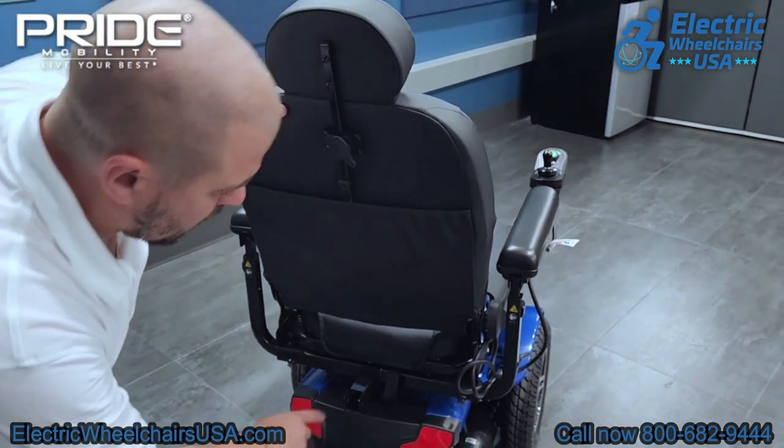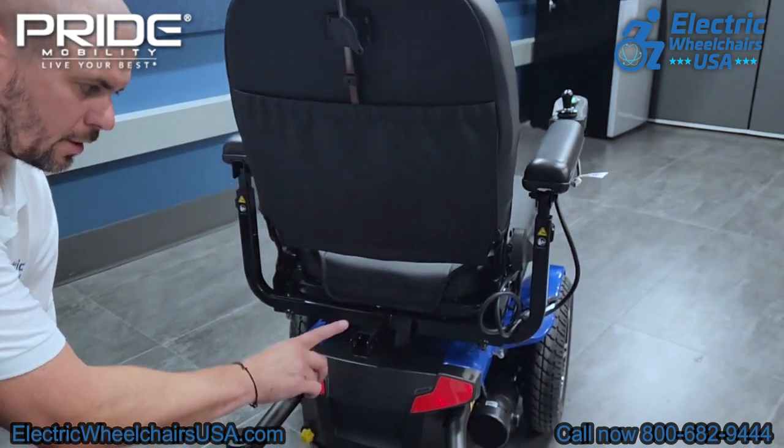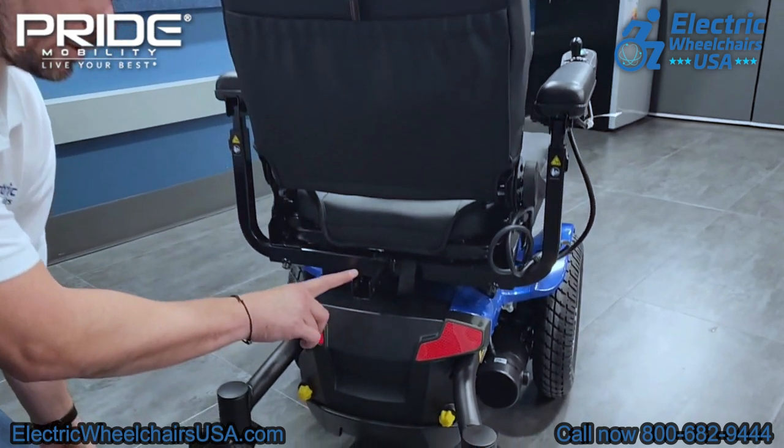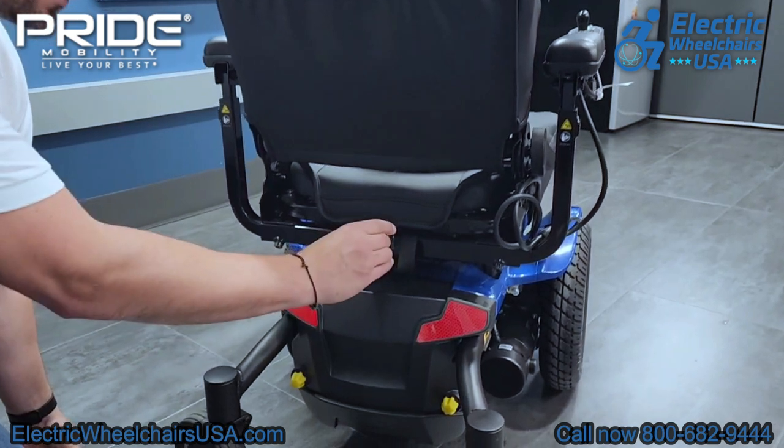On the back of the chair, there is a universal accessory hitch, so you can add different accessories onto the back of the chair. Just go to our product page and you can see what accessories are available to purchase to add on to this chair.